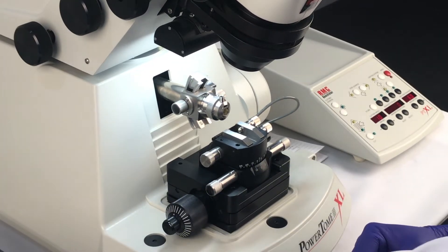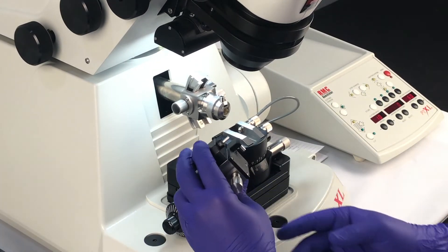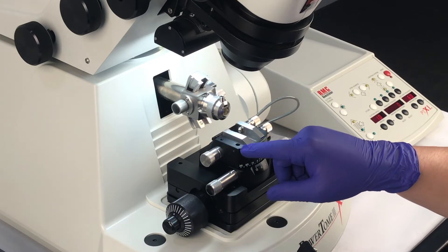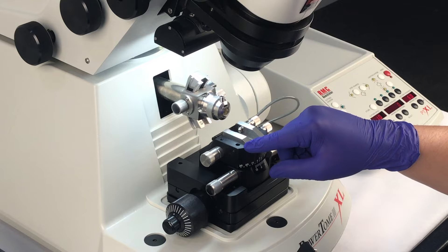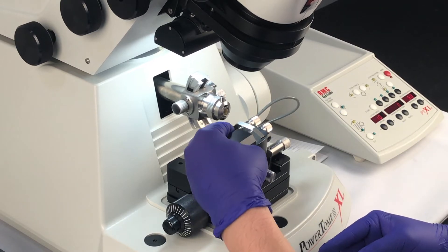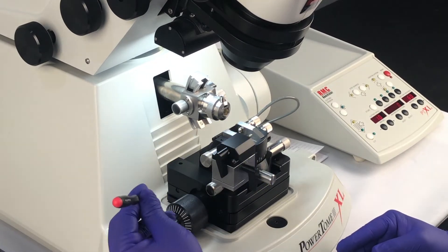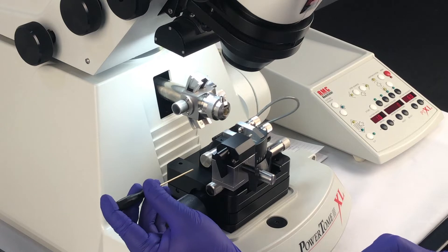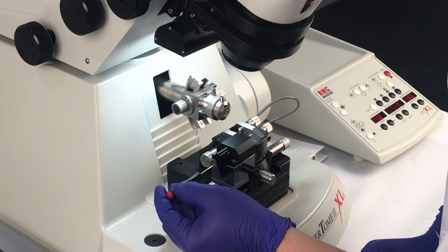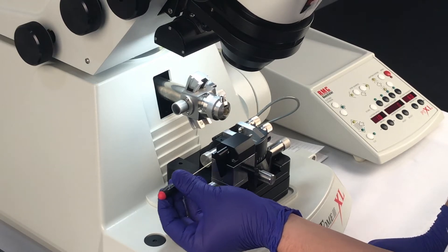Now we're going to mount the Ash 2. The Ash has a post which we're going to use to insert and align onto a hole that's located on the upper left side of the upper stage. Using the same 1.5mm ball driver, we're going to tighten or secure the Ash 2 with the mounting screw that we installed earlier. Just secure it until it's snug.